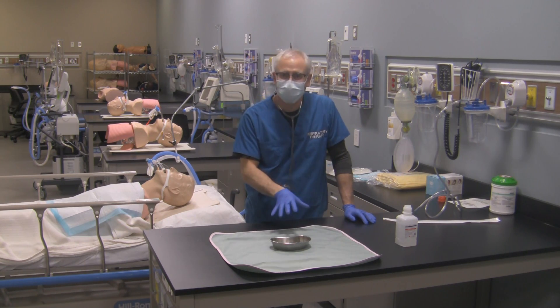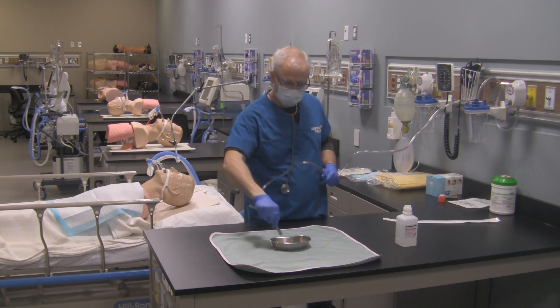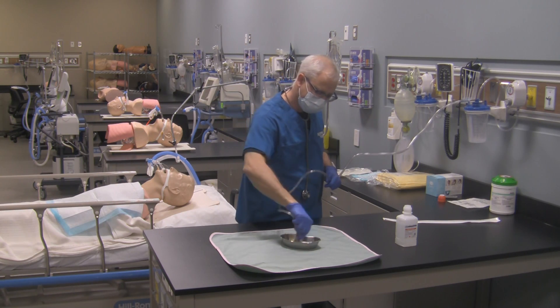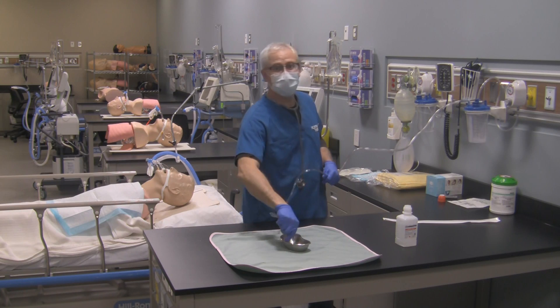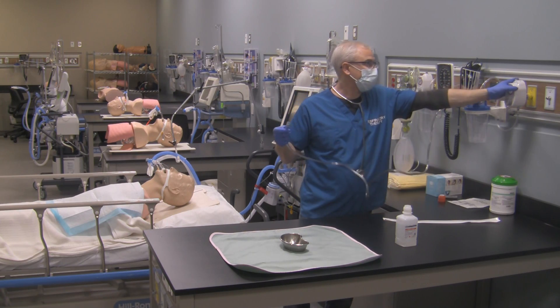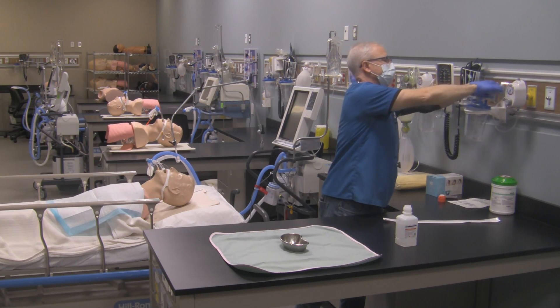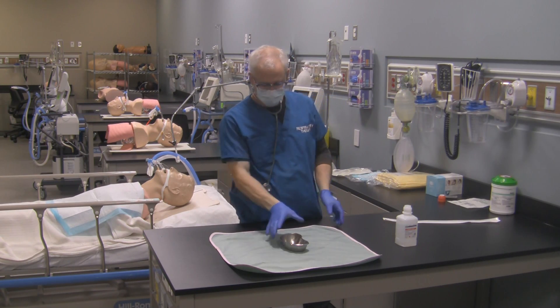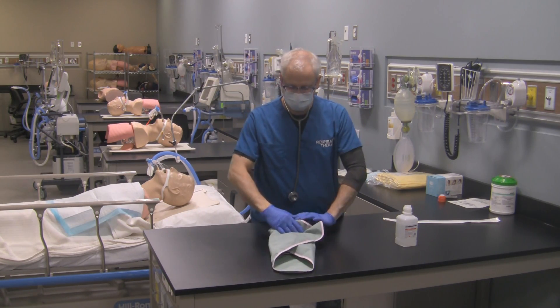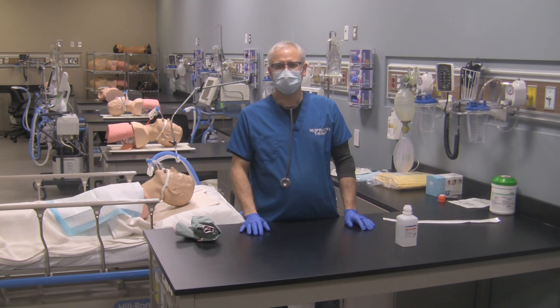Oh — clean up your area too, forgot about that. An easy way to clean it up: just take your suction here — your little vacuum cleaner — and suck out all the rest of that normal saline that you're not using. Get rid of it all because it's got the patient's secretions in there as well. Shut your suction regulator off. Hook the tubing up in a safe way — it should be cleaned out because you sucked all that stuff out. Now this suction tubing — depending on whether your center is going to be reusing it — should be packaged up and placed in the appropriate receptacle to go for cleaning.